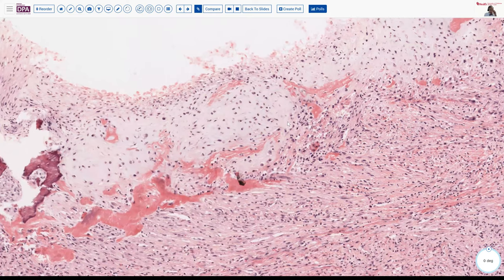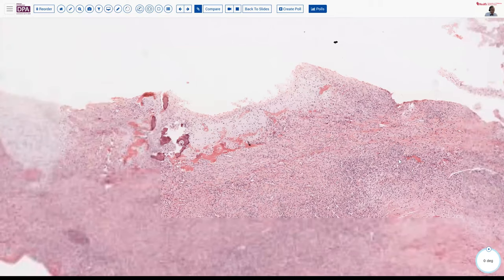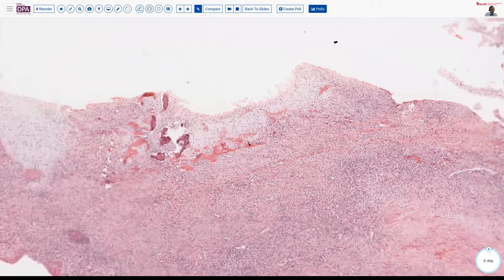By convention, we call this osteosarcoma if it's making bone. We use that criterion of finding atypical cells within the bony matrix as sufficient justification for that diagnosis, irrespective of whether there's also atypical cartilage present or not. So there's not a lot of this tissue here, but this is the clue to the diagnosis.